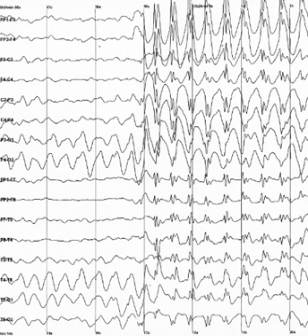Ultra-slow or near DC activity is recorded using DC amplifiers in some research contexts. It is not typically recorded in a clinical context because the signal at these frequencies is susceptible to a number of artifacts. Some features of the EEG are transient rather than rhythmic. Spikes and sharp waves may represent seizure activity or interictal activity in individuals with epilepsy or a predisposition toward epilepsy. Other transient features are normal, vertex waves and sleep spindles are seen in normal sleep. Note that there are types of activity that are statistically uncommon, but not associated with dysfunction or disease. These are often referred to as normal variants. The mu rhythm is an example of a normal variant.